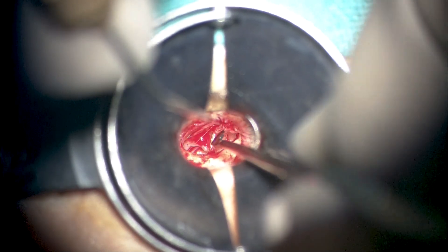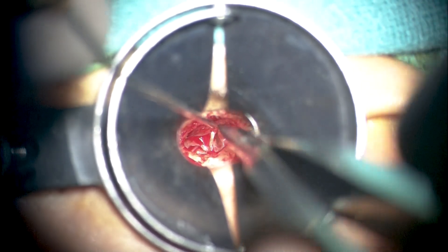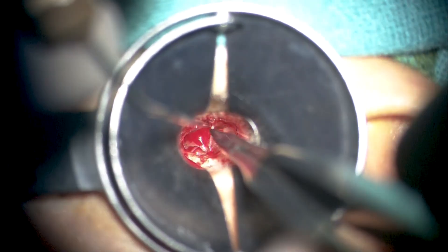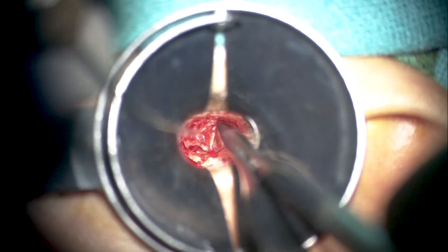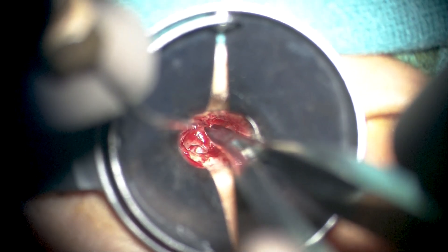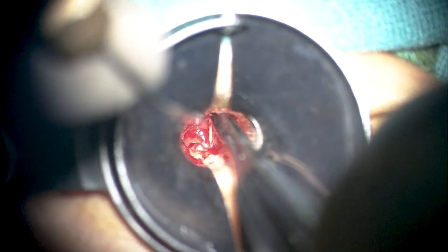As we elevate this retraction pocket from the chorda, most of the pars tensa retraction pocket has been elevated from the chorda tympani, which can now be seen very clearly. Where traction seems excessive, we again resort to the micro scissors to elevate the pocket from the surface of the chorda to avoid unnecessary stretch and pull on the nerve. One must be very cautious not to cut the chorda itself while attempting to elevate the epithelium from it. Straight forceps and straight scissors work best here, as curved instruments are at a very oblique angle and don't suffice.